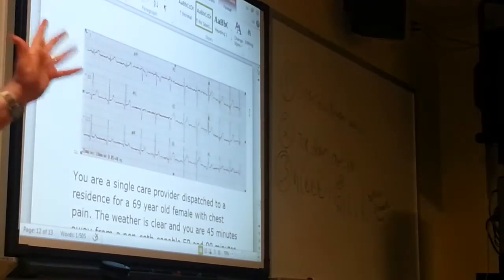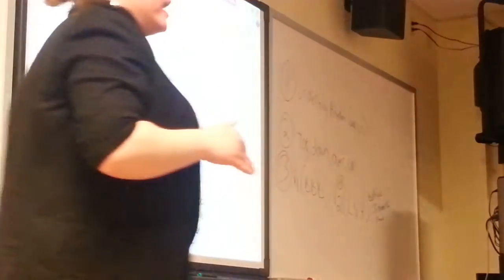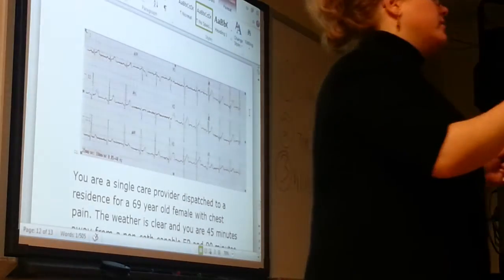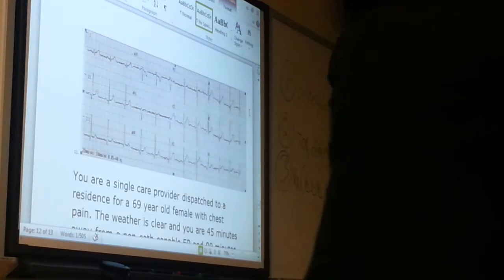There's a lot of counting of boxes, which I don't know about you guys, it drives me insane because, again, I'm dyslexic, and I also have the attention span of a gnat. I hate this. So, because I hate it so much, I work really hard at it, and I got really good at it. Whatever you have to do, take index cards with you, fold your paper, take a ruler, take your field guide, take your phone. Turn it sideways, upside down, fold it, make origami. However is going to work best for you to count boxes, make it happen.